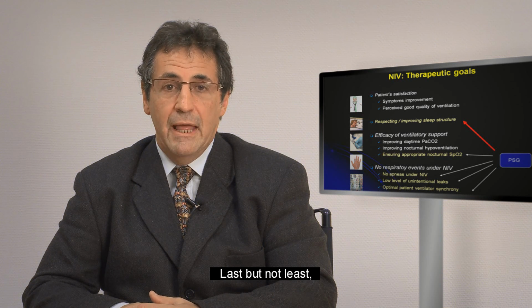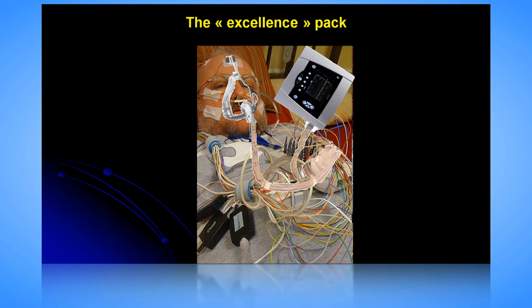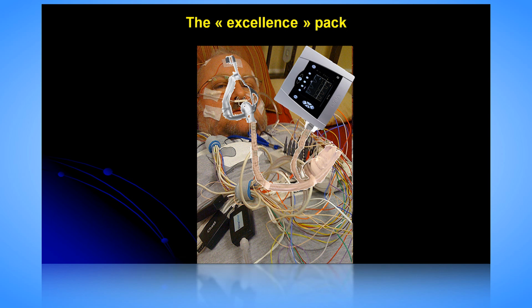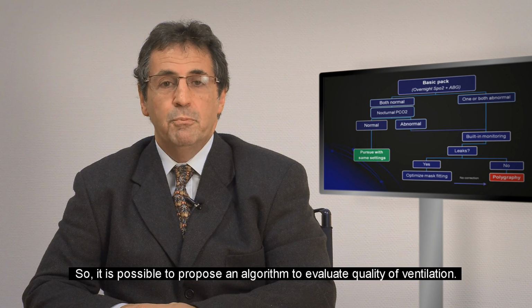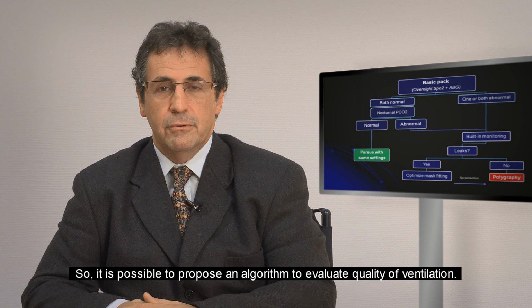Last but not least, polysomnography adds to this evaluation the possibility to assess quality of sleep. This is polysomnography, which I call the excellence pack. As you can see, there is a complex assembly that may penalize quality of sleep during the night under ventilation at the hospital. So it is possible to propose an algorithm to evaluate quality of ventilation.